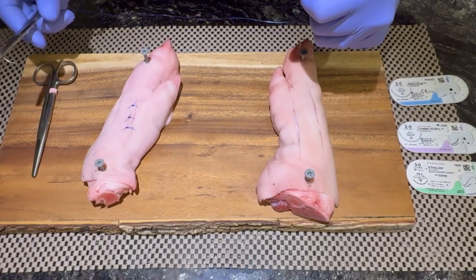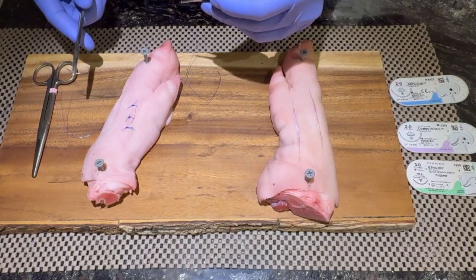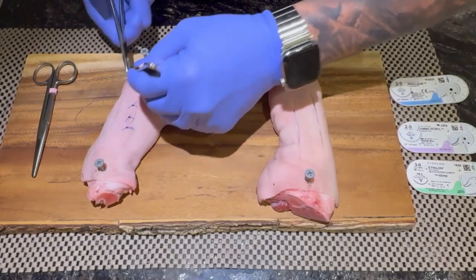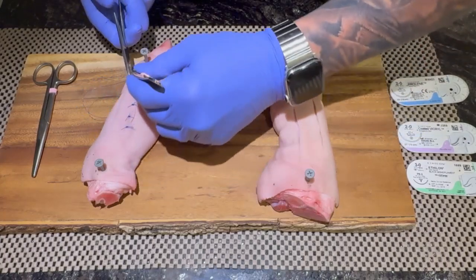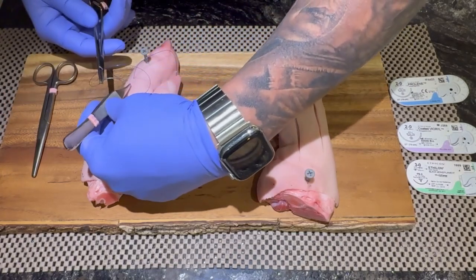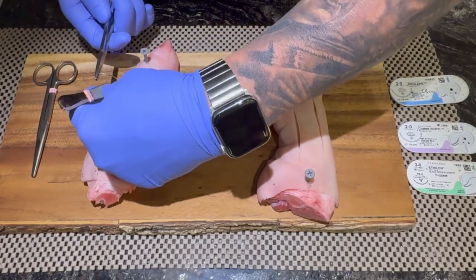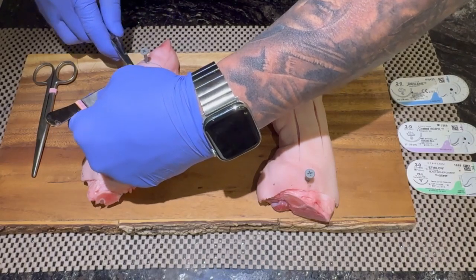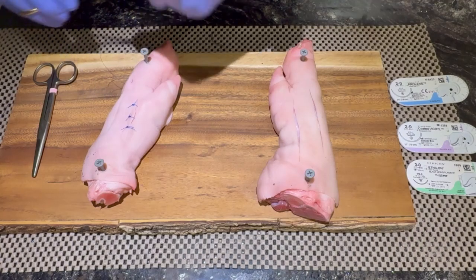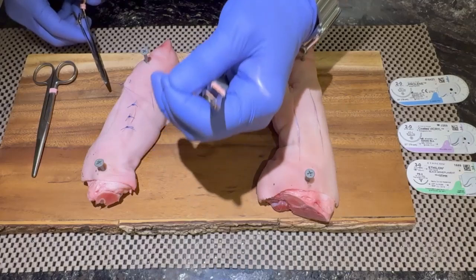We can always do what is called a horizontal mattress, which is very simple. We go in one side of the skin, cross to the other, under. Then we pull it through, keep the tail on the other side, so just grab it. Going parallel to the wound, take it out, then go from the inside to the outside, and now your stitch is going to run horizontally, the same as the wound. That's why it's called a horizontal mattress.